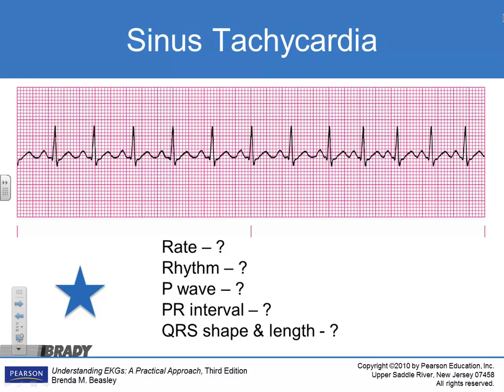All right, look at this one. See, what's the rate here? For this, I'd take 120, you know, it's getting up to 130. What's the rhythm? It's regular. And here when I say rhythm, I'm looking for, you know, is it fast or slow pretty much, sinus tach, sinus brady.